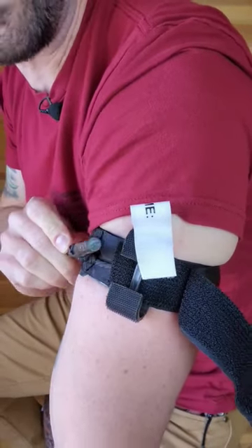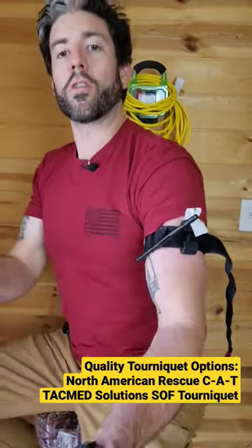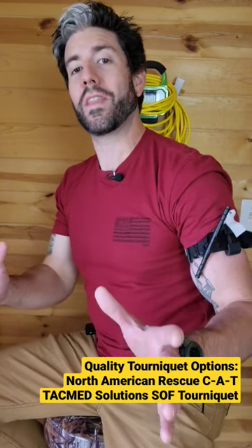These are dangerous. Make sure you get rid of these if you have them because they will fail you. I have a bunch of them because early on they seemed like a good deal — they're not a good deal. You'll die from them, so get rid of these.